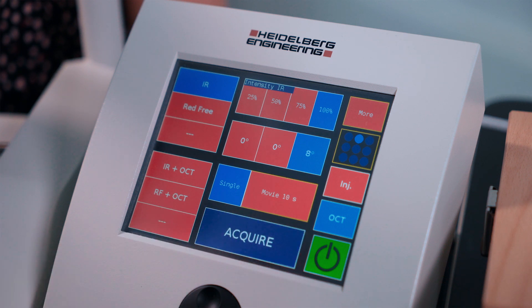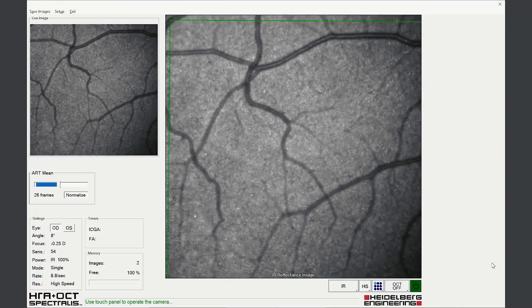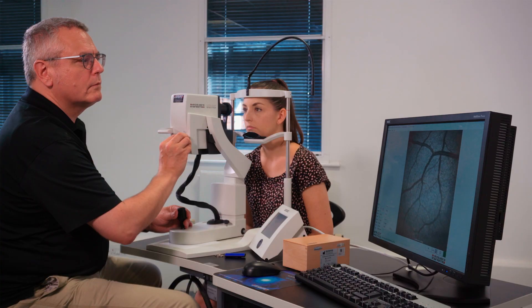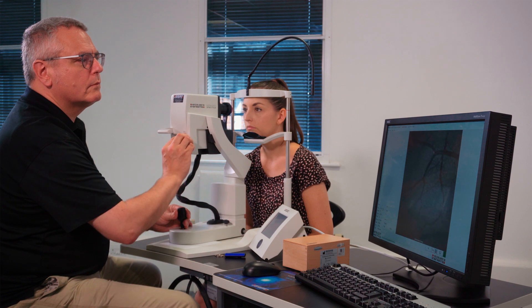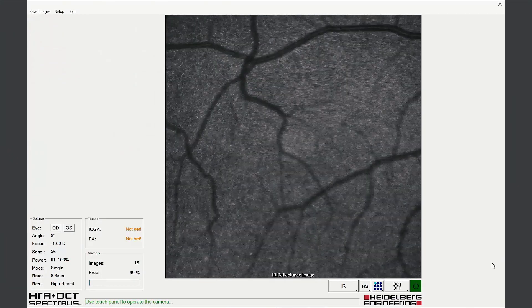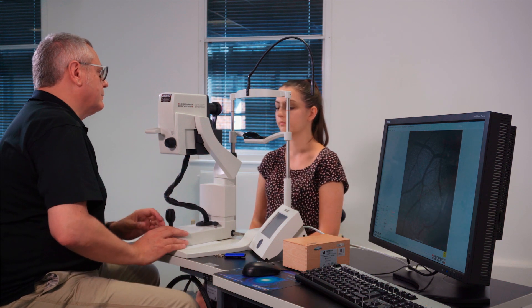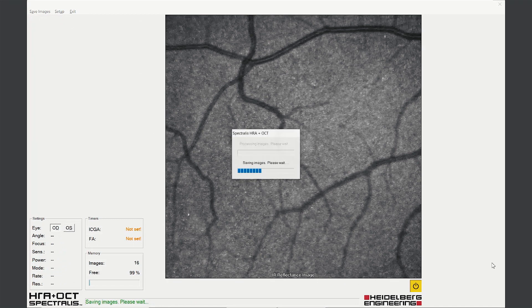Images should be acquired using ART, with and without normalization, and with and without eye tracking. Multiple images may need to be recorded in order to document the fundus appearance completely. At the end of the examination, exit and save images.